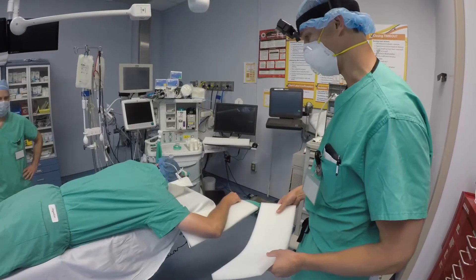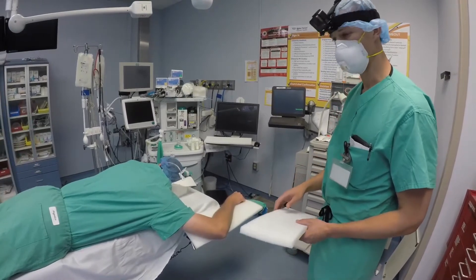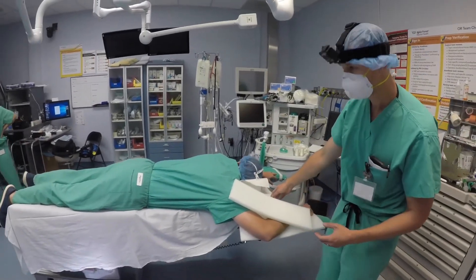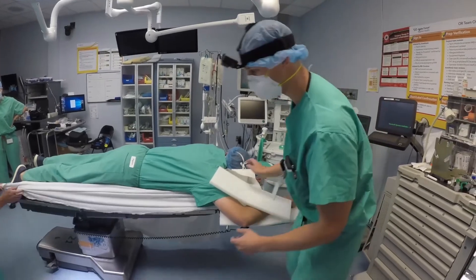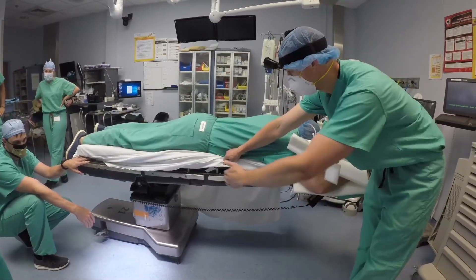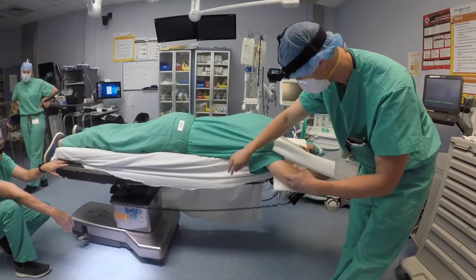We're going to go over prone positioning for lumbar surgery. The patient is already on the table. One thing to notice is that the bed has been reversed — the normal head of the bed has been placed on the longer side. This allows more room between the base and the arms to get a fluoroscope underneath and localize for surgery. This is done after the patient is positioned and usually prepped.